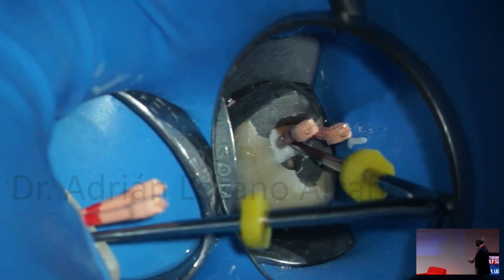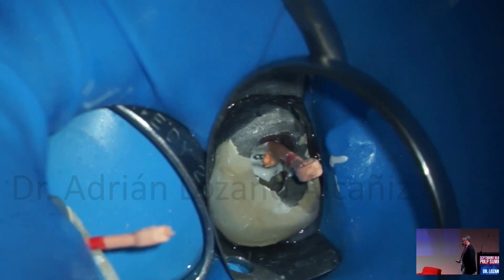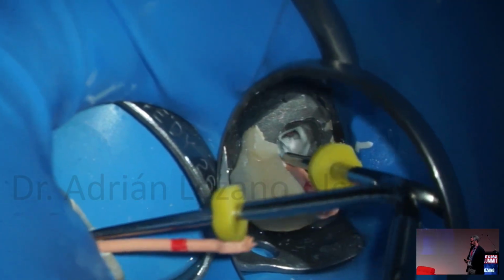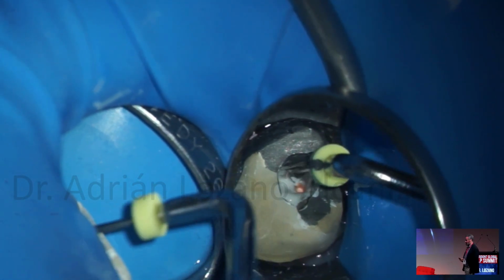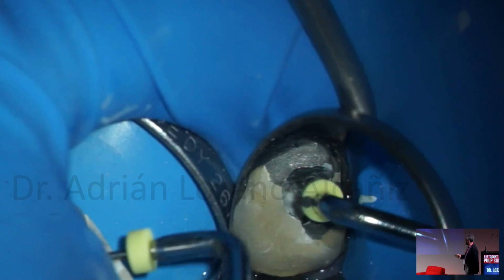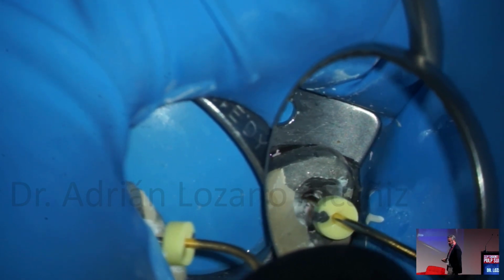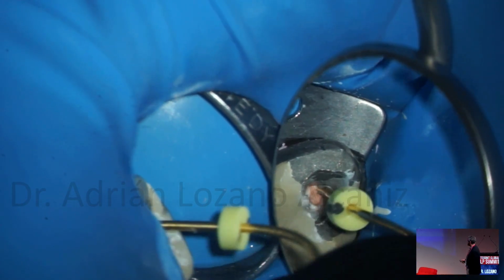Then we cut at the orifice level in the MB2, and I go through the middle of the canal in the MB1. Then after cutting the gutta-percha, we must plug the gutta-percha. We plug the MB1 and MB2. And the difference is we have to do the backfilling in the MB1, where we have done the warm technique. So we go with the extruder of the gutta-percha. And that's it.